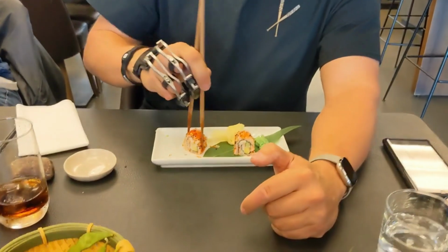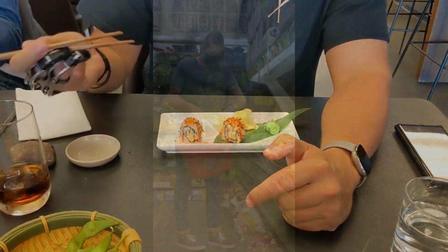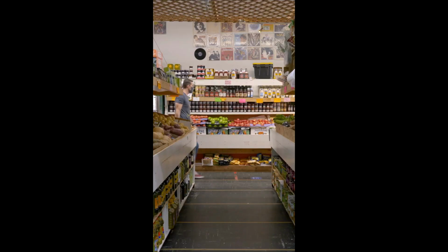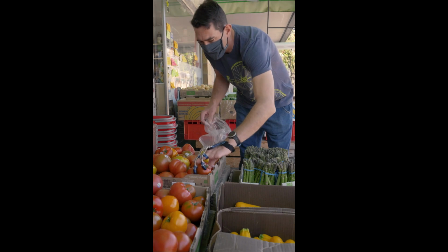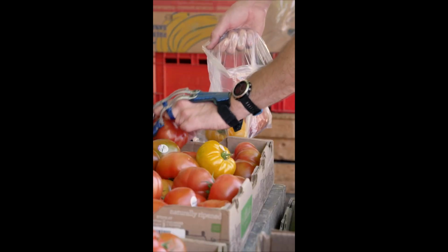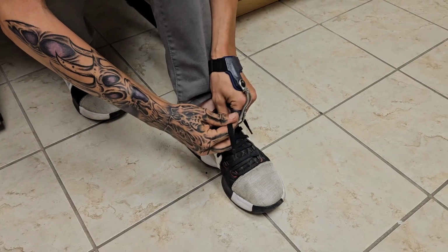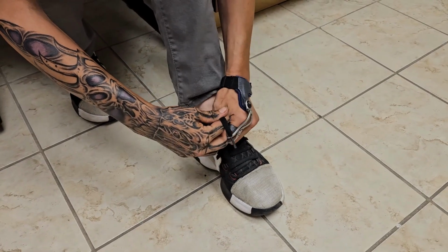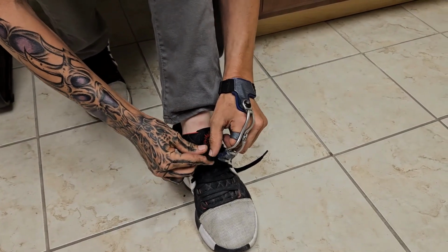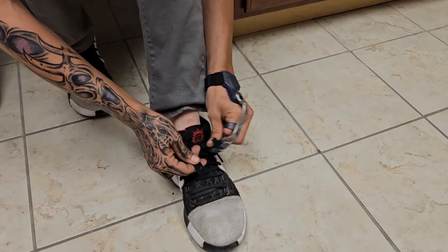Yeah, most people can't use chopsticks. I can't use chopsticks. What's the terminology we use, Mike? One thing comes to mind when we're looking at amputees that are transradial, transhumeral, where terminal devices and things like that are tools. Everything's a tool. Yep. And there's not one tool that does all jobs, and that's the case for anything in the prosthetic world. But this is essentially a tool or a prosthetic device that really does quite a bit. Absolutely.